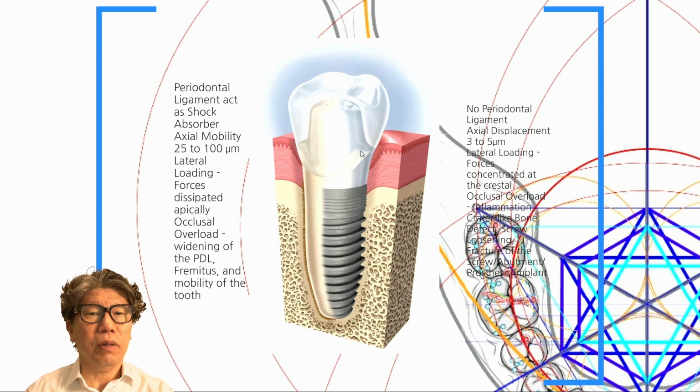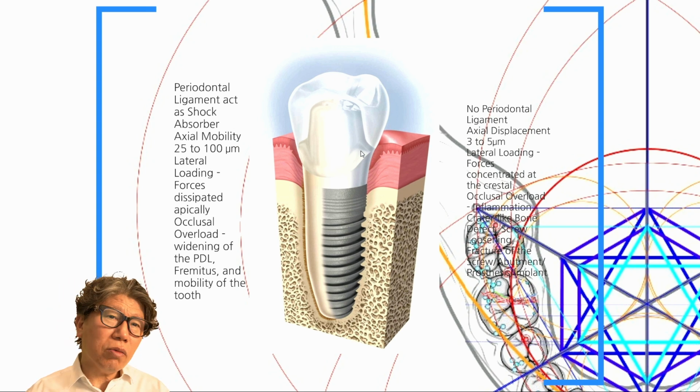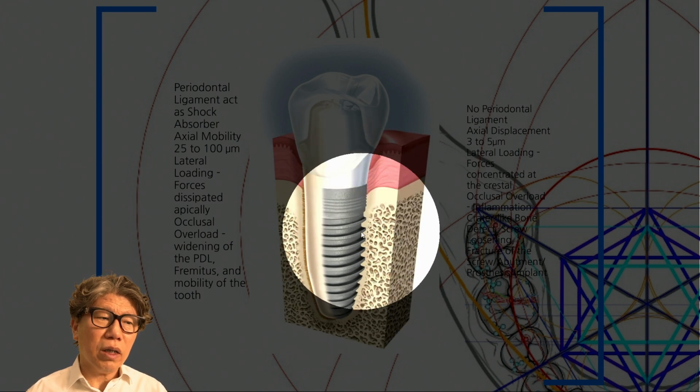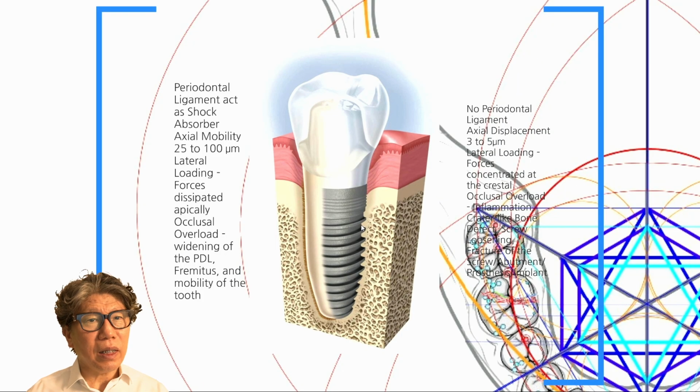The implant abutment keeps breaking and the screw keeps breaking, so almost all companies want to use a material with higher strength. However, using a material with higher strength does not mean the screw won't loosen. It seems that because the screw often loosens, many dental directors as well as patients are experiencing discomfort. That's one thing. As a result, the fixture surface and the bone tissue make intimate contact.